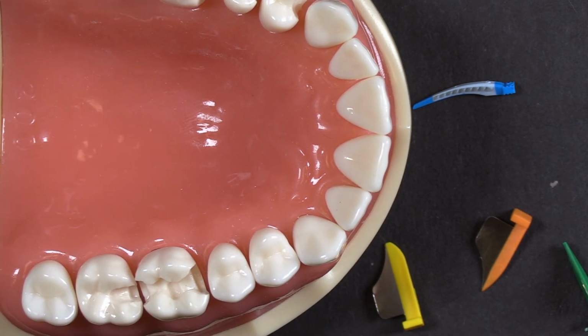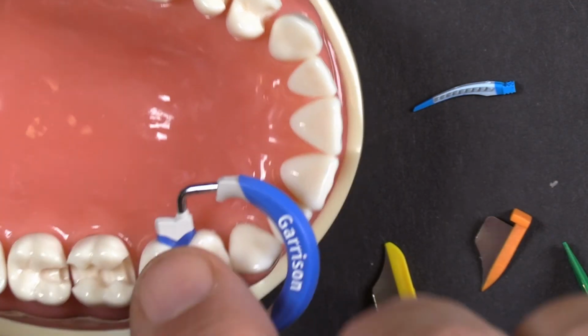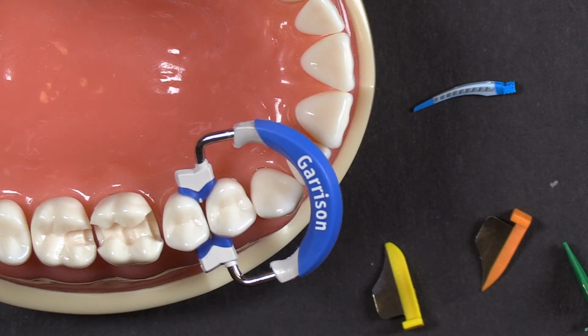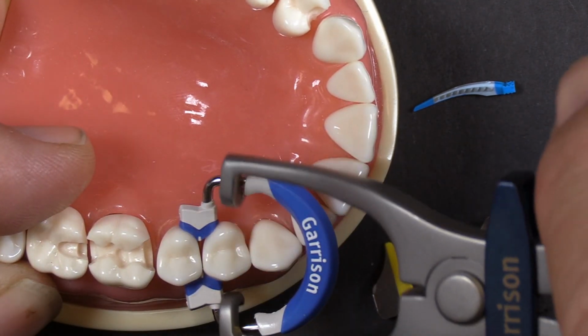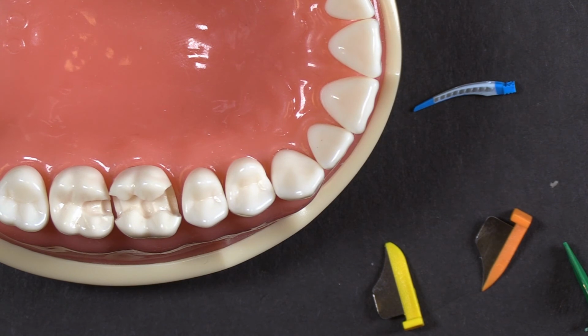Now, if you've done that and there's still not enough space, you can't get the band in, well, put a ring on there. The ring is going to start performing that same function. It's going to push on those ligaments, stretch them out. Go do a hygiene check. Come back, and that will have moved the teeth a little bit, hopefully enough for you to get that matrix band in. So you might give that a try.